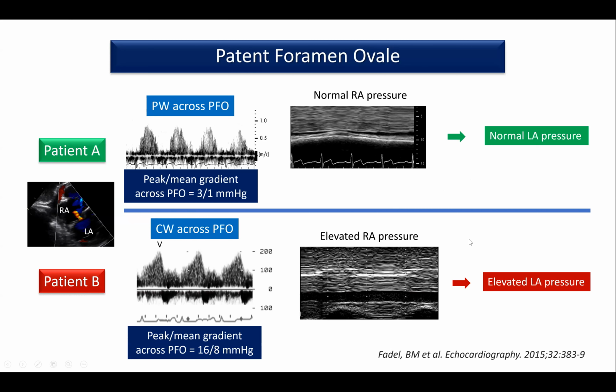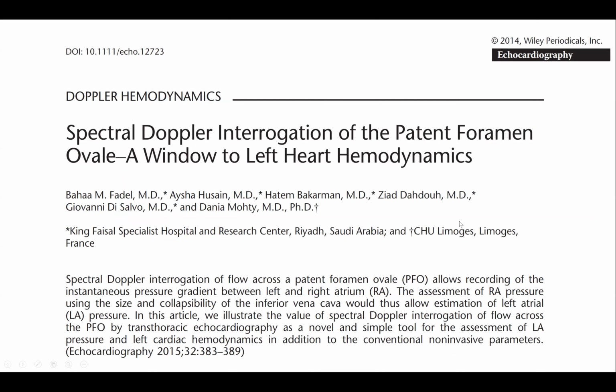So take advantage of the patent foramen ovale, try to line up with it and use it. I mean, this is not in the guidelines, okay? I wrote a paper several years ago, maybe now 9 years ago, about using patent foramen ovale as a window to the left heart hemodynamics. It can give you tremendous information.